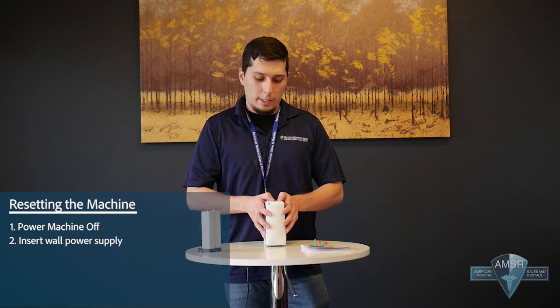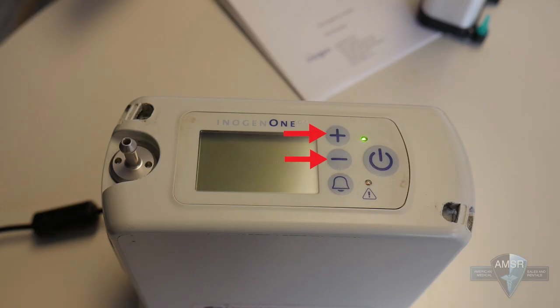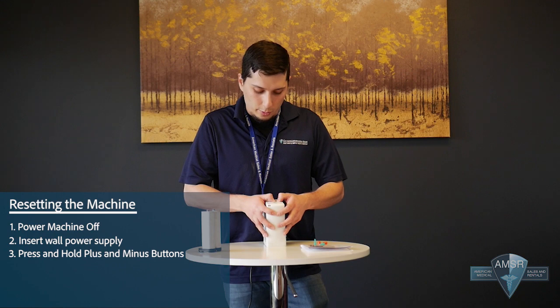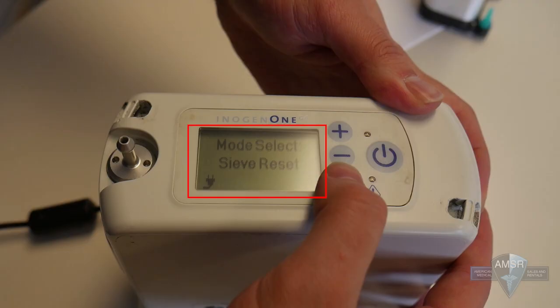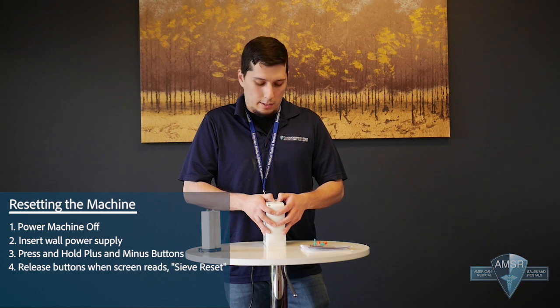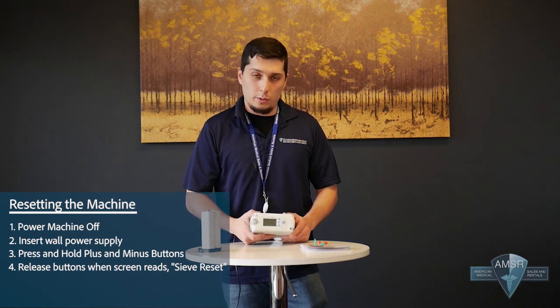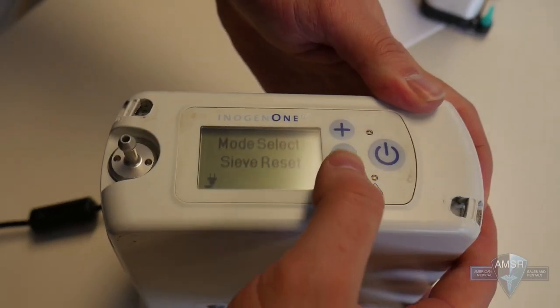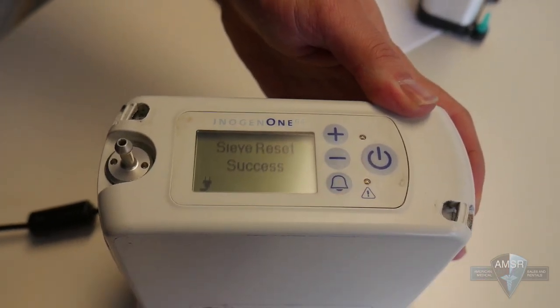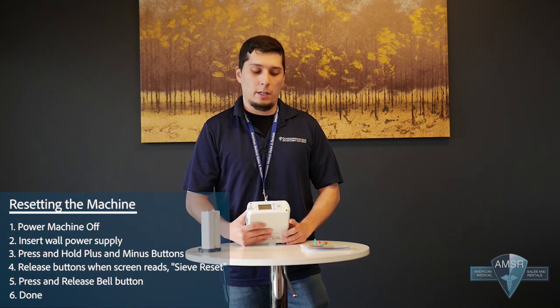So you're going to press and hold the plus and the minus button until you see the words "sieve reset" on the top of the screen. This process can take 5 to 10 seconds. So once you see those words, sieve reset, you're going to press and release the bell button once. It's going to say success, and you're ready to use your machine.